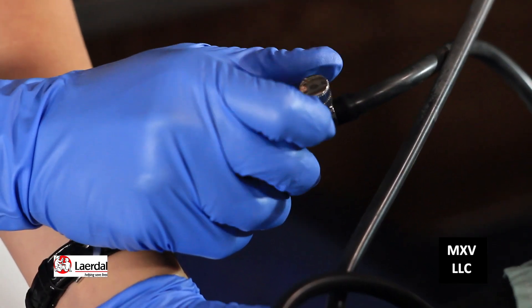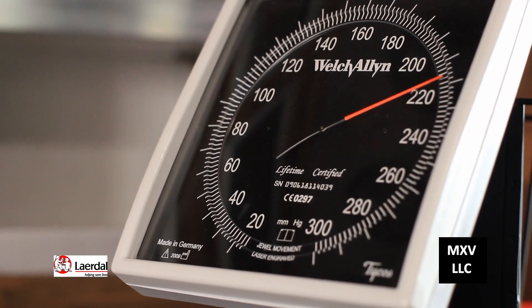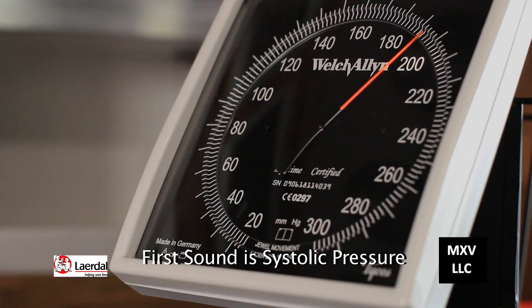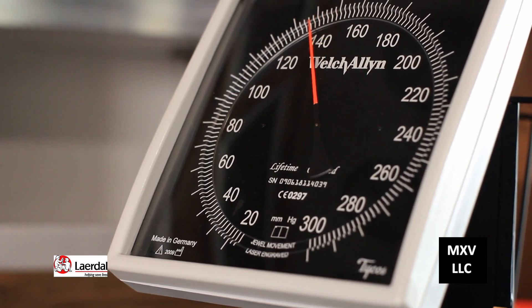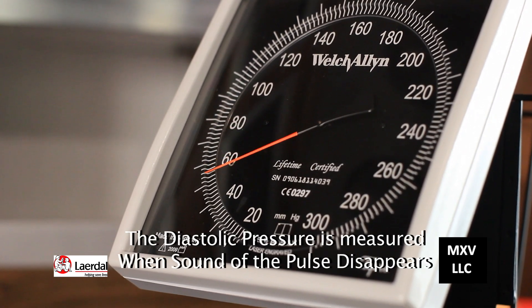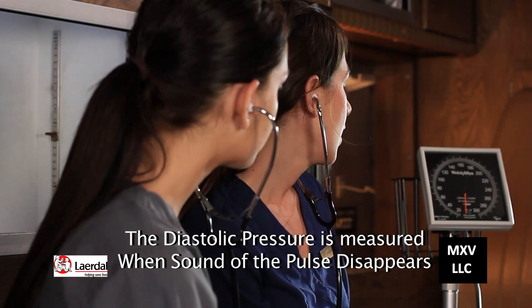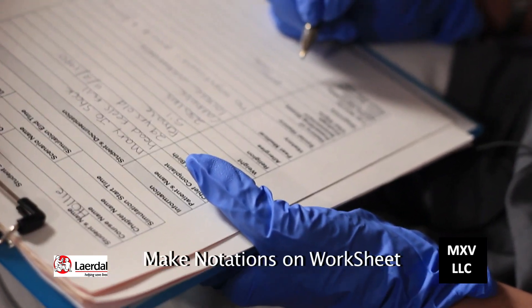Then let the valve loose — turn it to the left nice and slow and listen for the sounds. The first sound that you hear is the systolic blood pressure reading, and the last sound is the diastolic. The reading is 200 over 110. Make those notations on your clipboard.